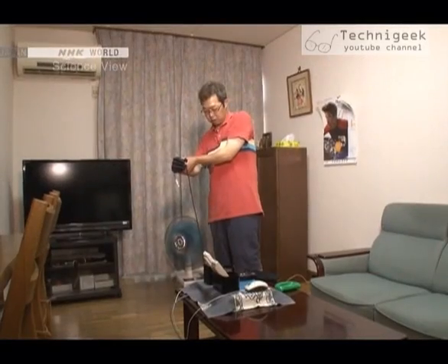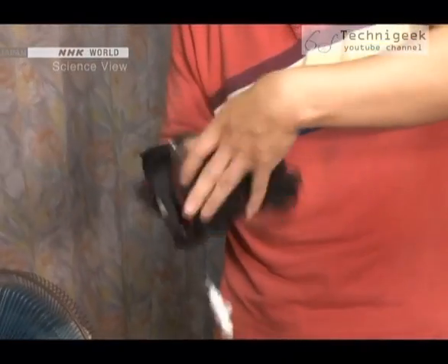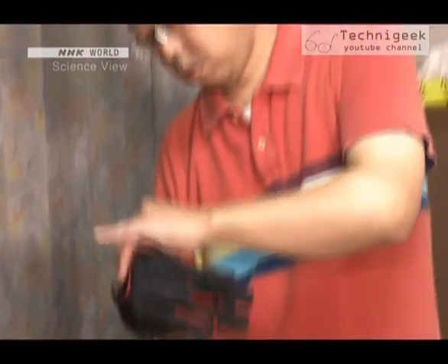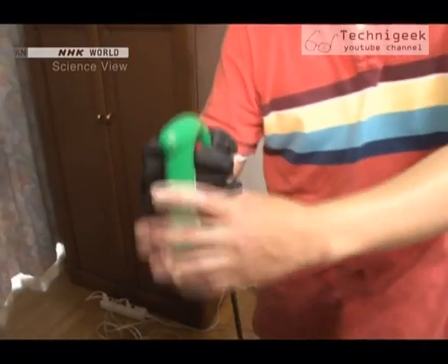I couldn't carry things by myself and had pretty much given up on it. The turning point came about one year ago. After seeing the news that a person with an injured cervical spine was able to ride again with these gloves, Itami immediately got a hold of it.